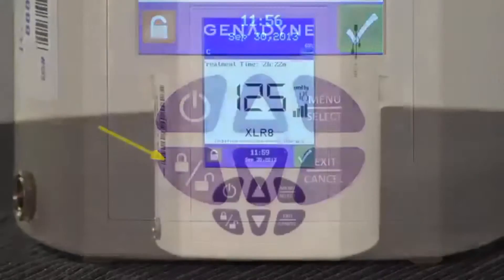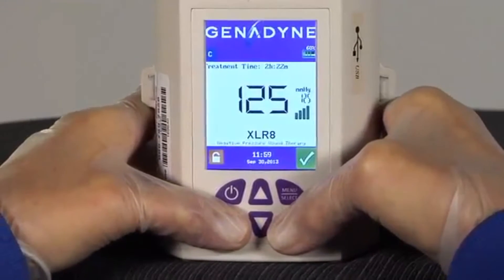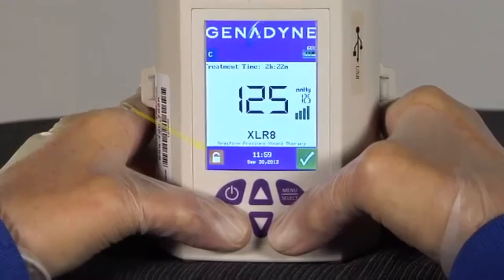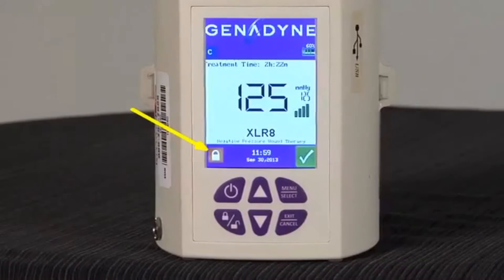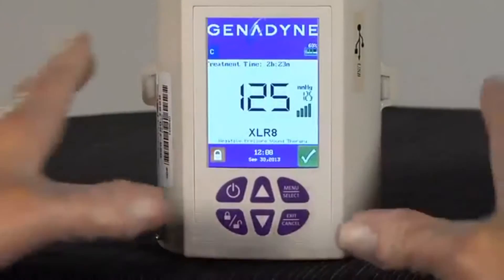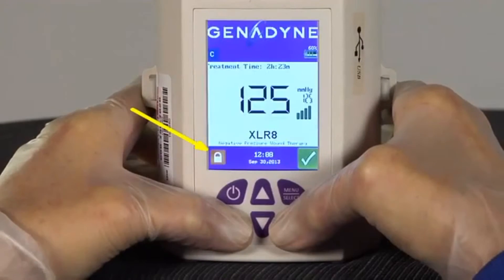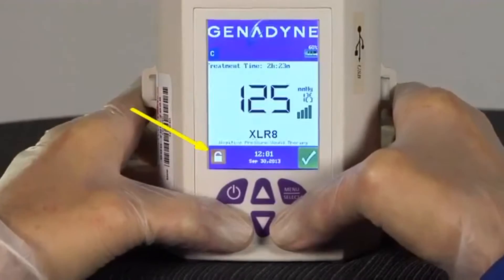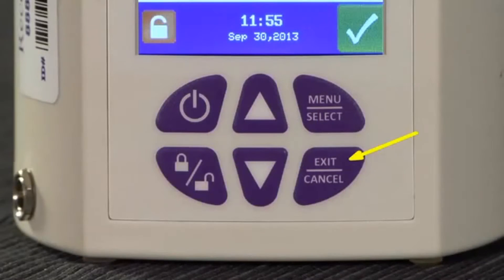To lock the device, simply press and hold the lock-unlock button and the exit-cancel button simultaneously for 3 seconds. To unlock the keypad, simply repeat the same process. The keypad will now be locked and the lock icon will change to the lock position. To unlock the keypad, simply repeat the same process and the lock icon will change back to the unlocked position. Finally, the exit-cancel button allows the user to exit the system menu and cancel current or selected functions.